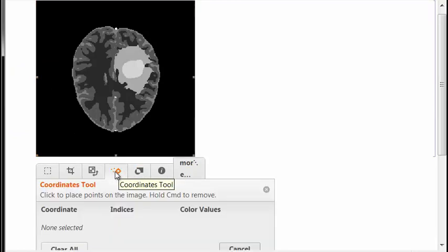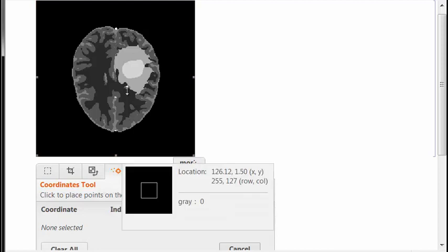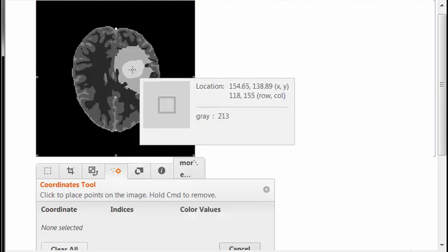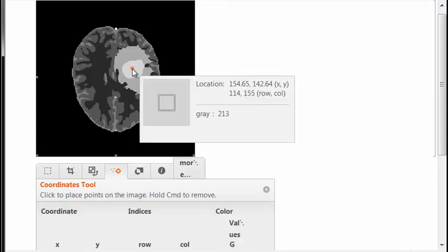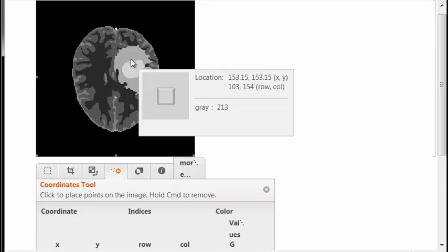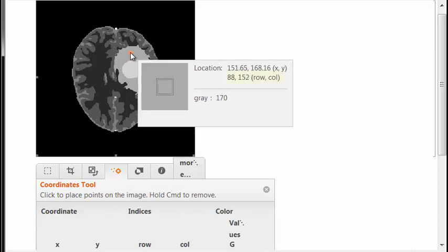We start by looking at a single slice in the truth dataset. We can use the coordinates tool on this slice to get indices for tumor and edema. We can point at them and take note of their XY coordinates. In fact, we only need a single point for each.